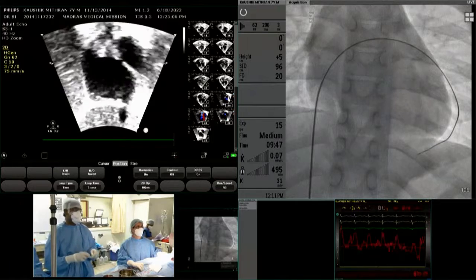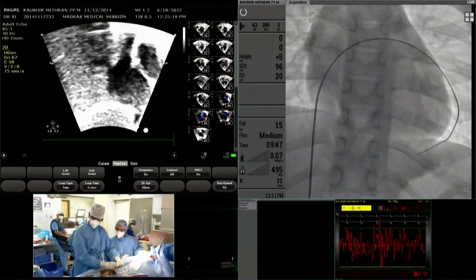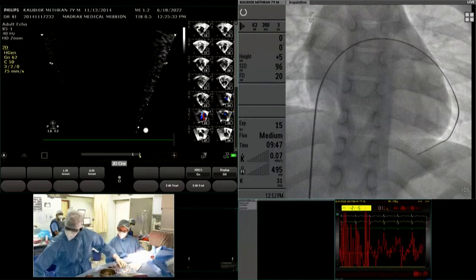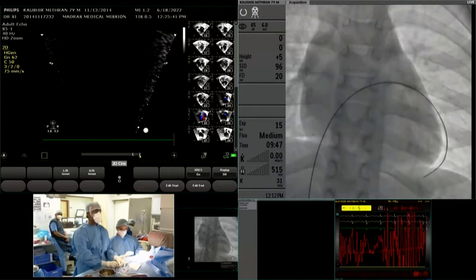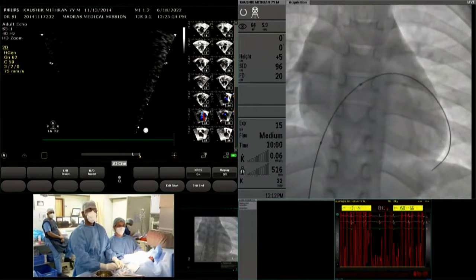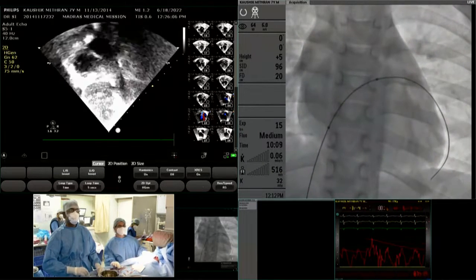Yes. And possibly my wire is going through that. Unless you put a balloon. Hold the wire. That is true. Tyshak balloon is a... But they are inflating in such a way that just to get the indentation, not to dilate that. Ideally, you need to have the sizing balloon, but 24 is going to be big for this. And probably 18 shortage is there. Amplatzer 18 is not freely available. So the next balloon, Tyshak only, is better, because remaining balloons are much more non-compliant than Tyshak.